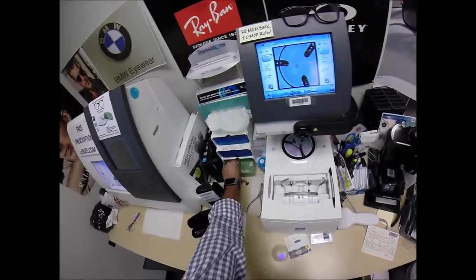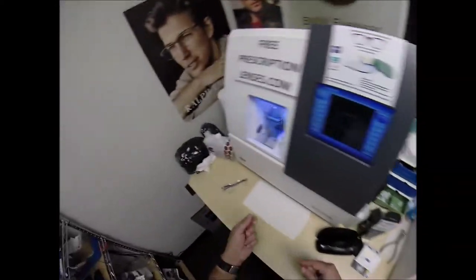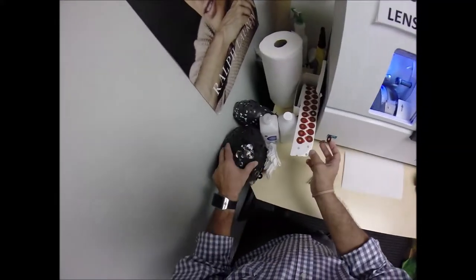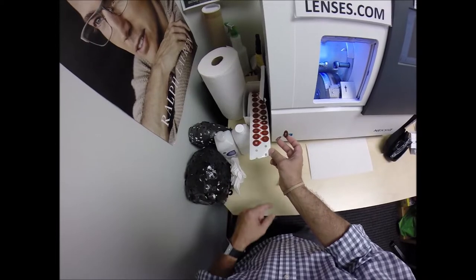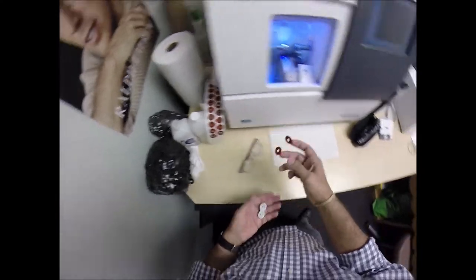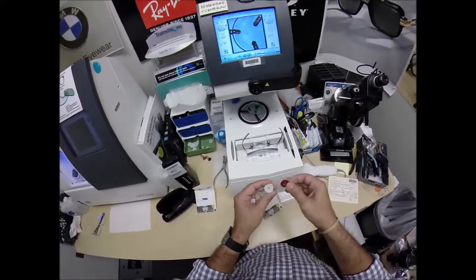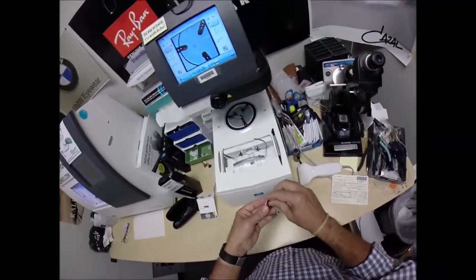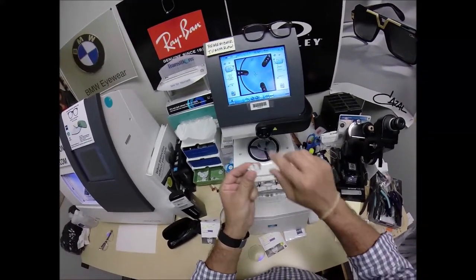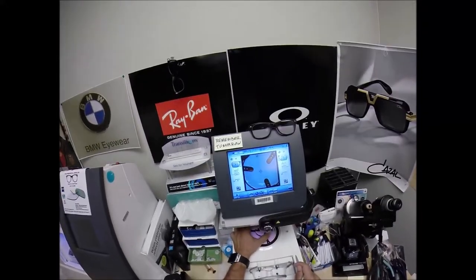So, this is a block, or as I like to call it, Jenny from the block. I need to attach this to your lens while it is cutting. I'm out of stickers. I will come down here to my sticker stash. You know, is it taunting it, the live ones, before they've gone to the slaughterhouse that I put their dead, used up carcass over there. Those of you at home may be asking, how much coffee does this guy drink every day? All right, so pull the paperweight and make the black side sticky. I'm gonna line up this, that silver button is a magnet. I'm gonna line it up with the magnet here in the arm so it stays. Stay, be a good sticker. Be a good Jenny from the block.